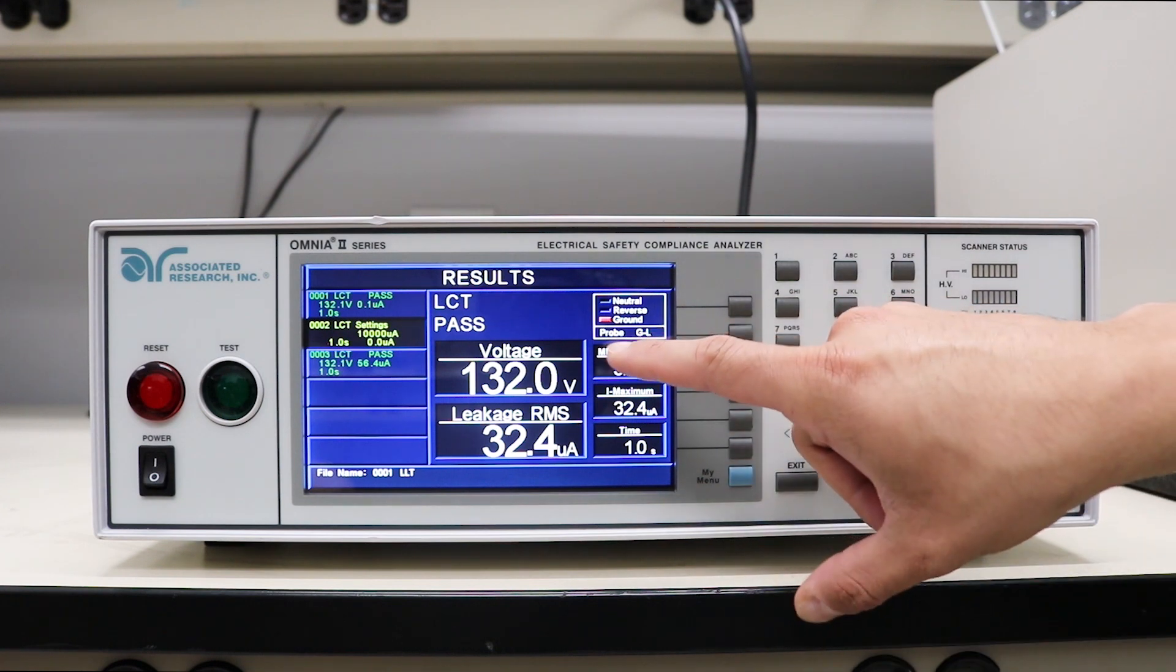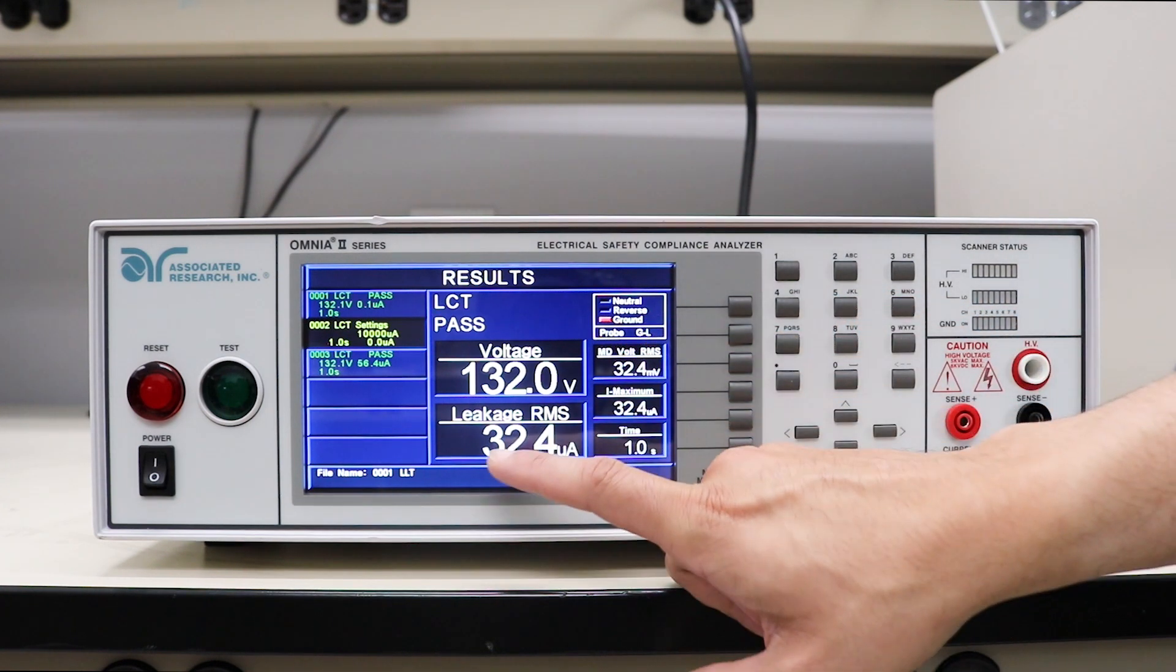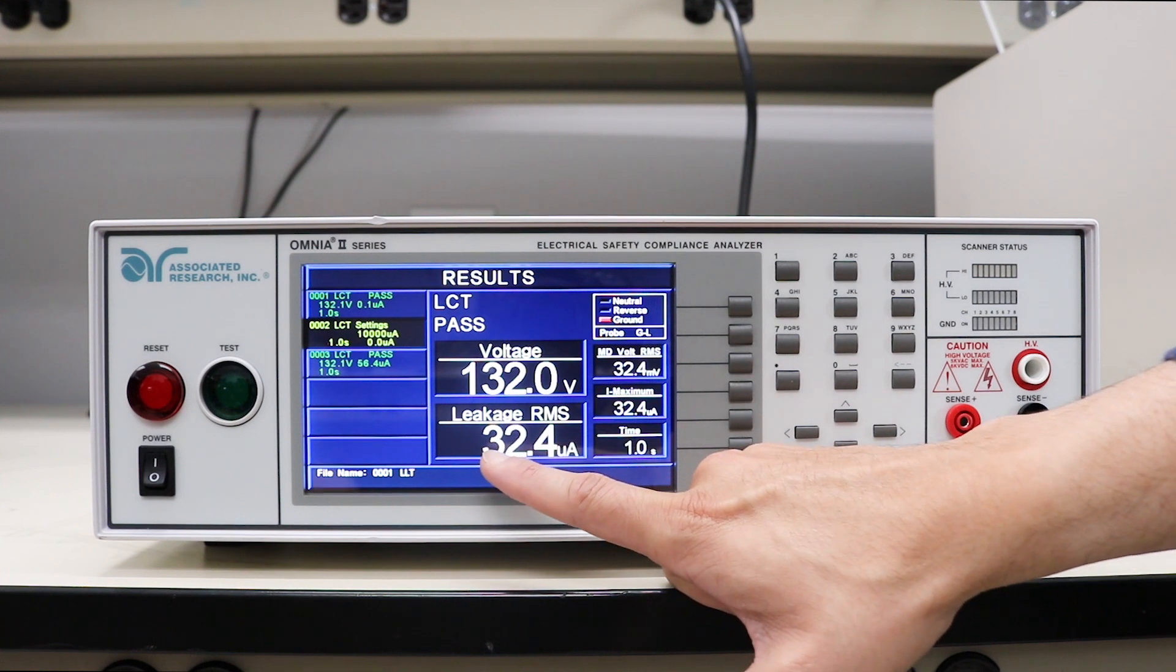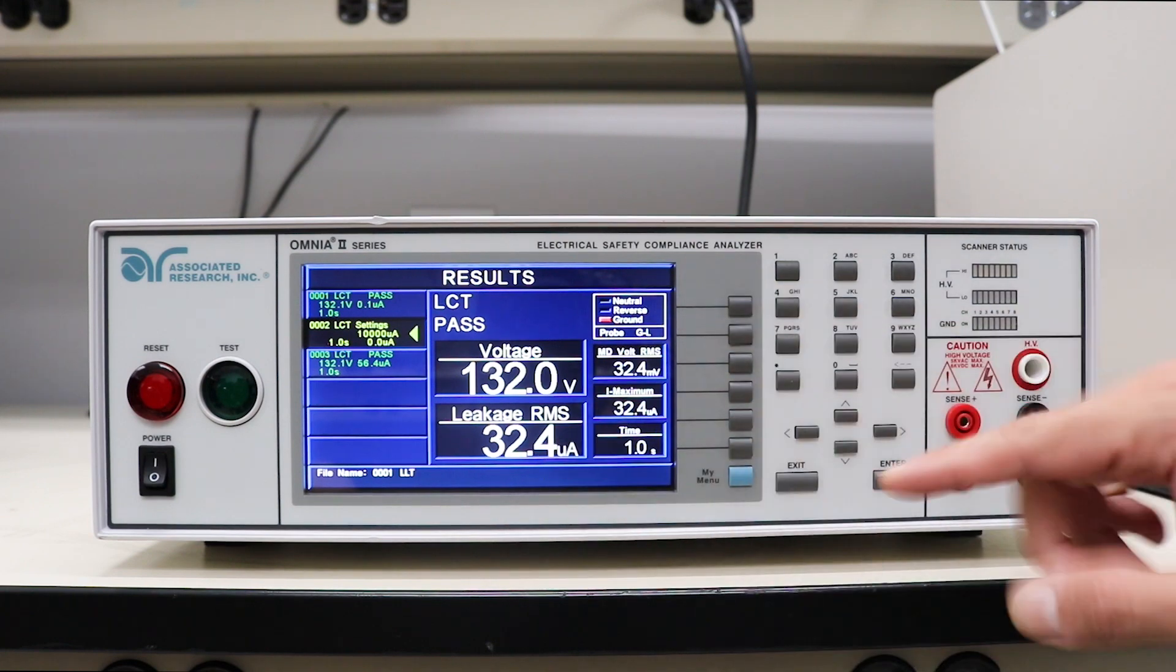In the next step we opened the ground and simulated an open ground condition. As you can see, the leakage current measurement went up quite a bit, all the way up to 32.4 microamps.